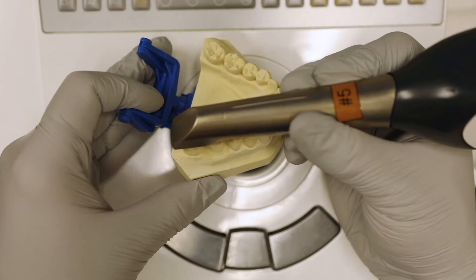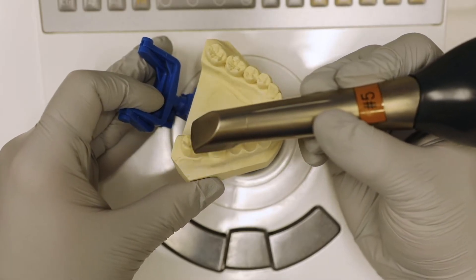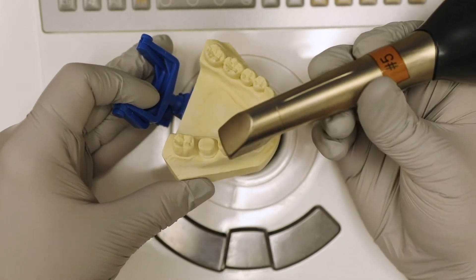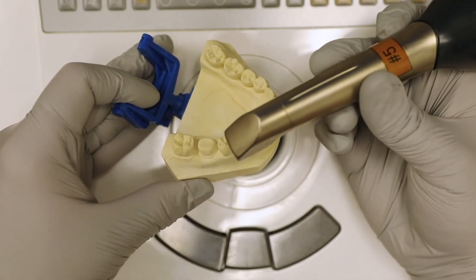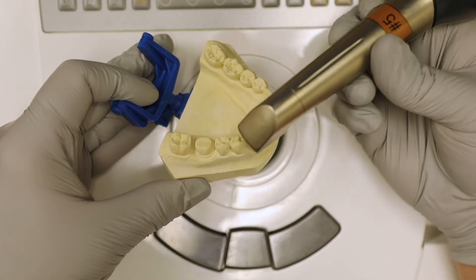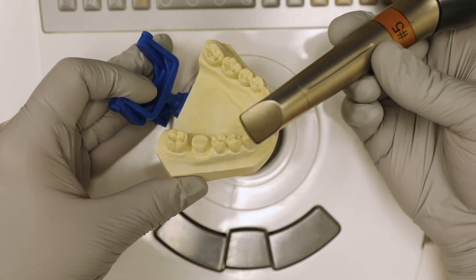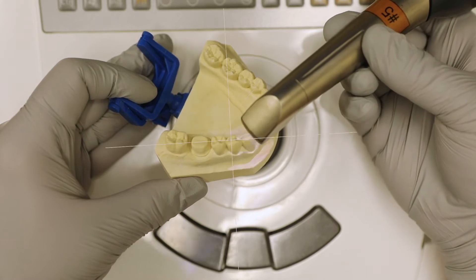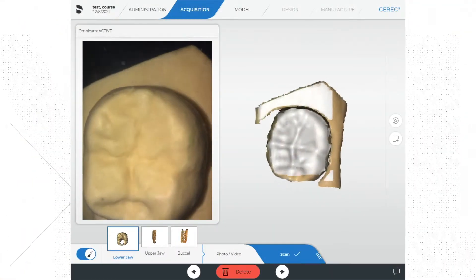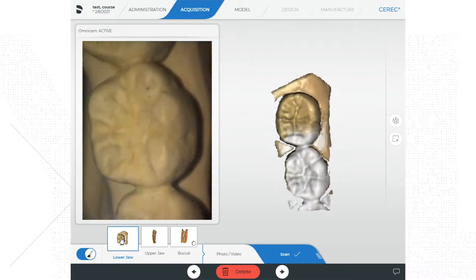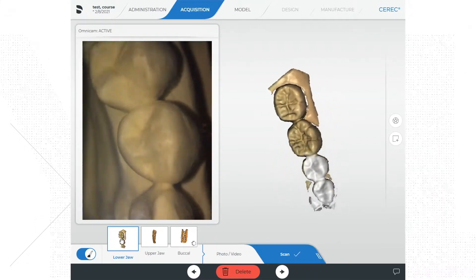Alternatively, you can use other modes of tissue management based on your personal preference. When you scan, you start scanning from the front and move towards the back, or you can start at the back and move towards the front — whatever you prefer. Whatever you choose, try to start your scan on the occlusal surface if possible.